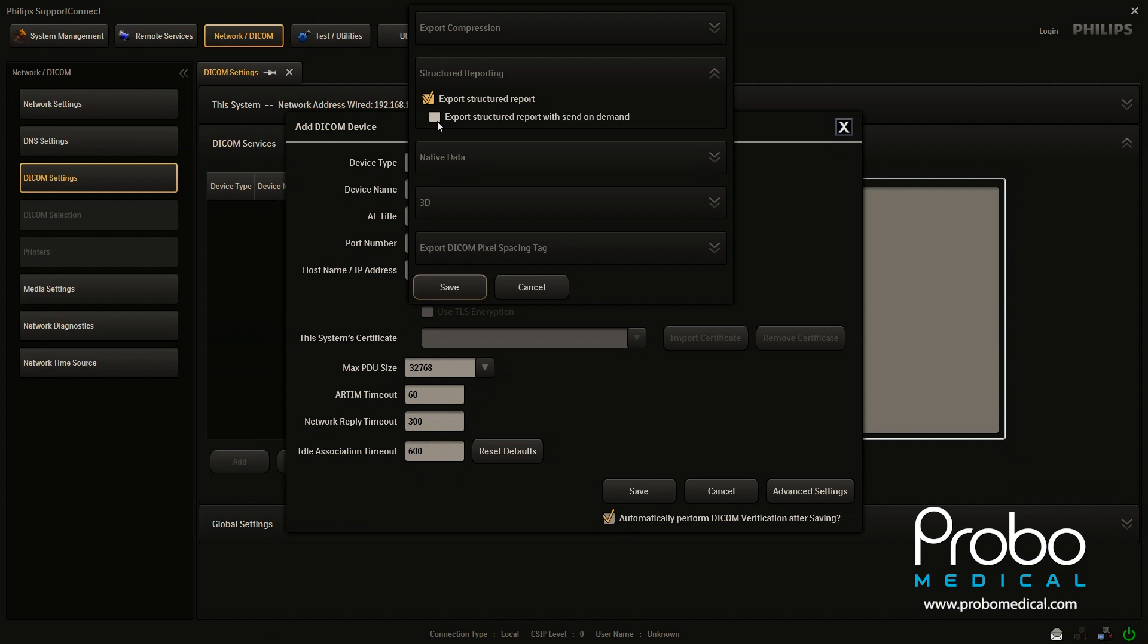I've only ever had to use that one time with one particular PACs product. So you may or may not need to use that. But you definitely want this export structured reporting box checked.